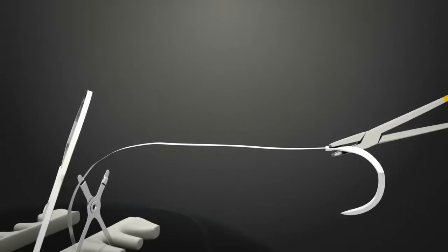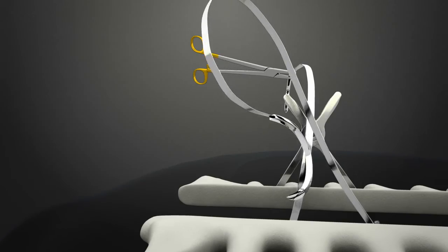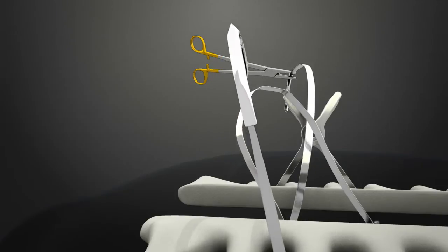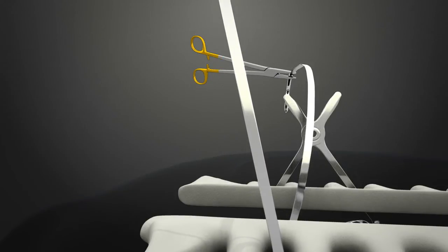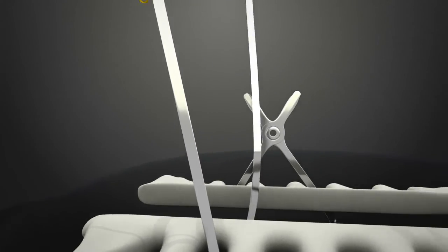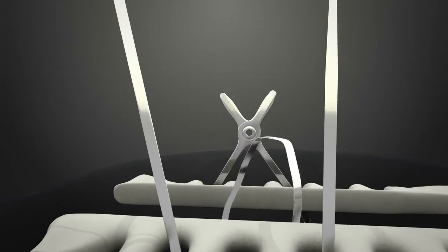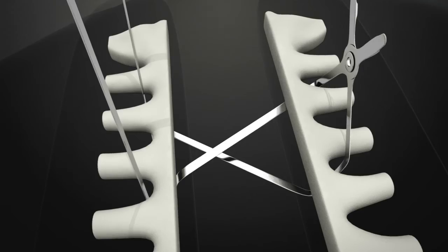The cephalad needle and strap are protected, and the caudal needle is passed through the near sternal half in a more cephalad position on the sternum. Then the cephalad needle is placed in a more caudal position on the near sternal half, thus crossing the straps.